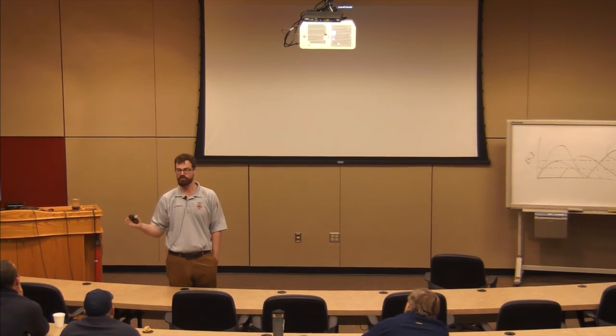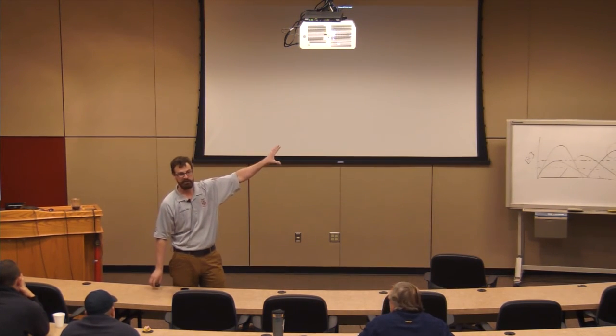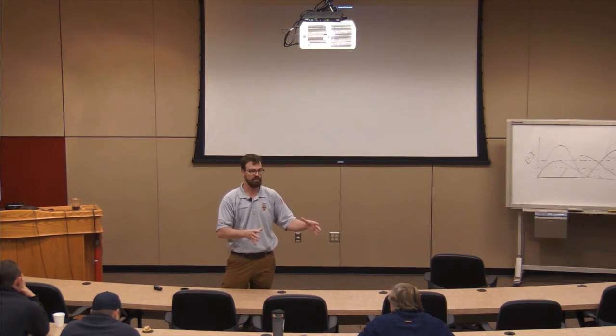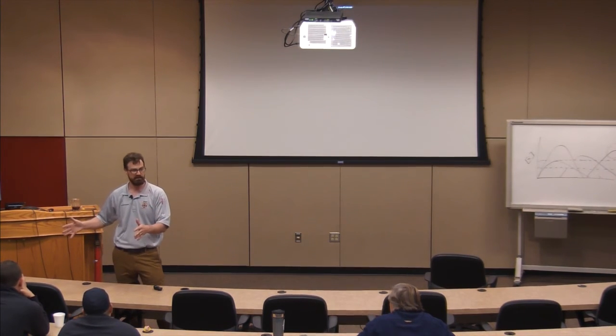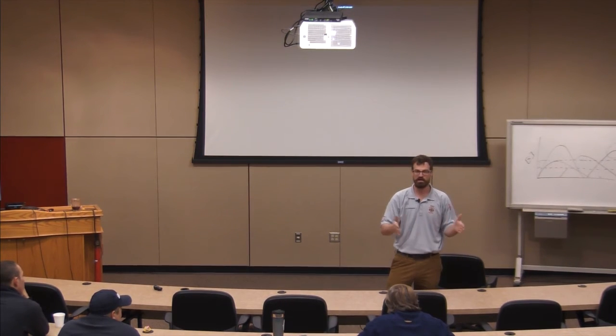So the moral of the story is you don't have to remember everything that's up here, right? We covered a crap load of material. The whole purpose of this is to introduce you to using the EKG in the setting of overdose as a diagnostic tool. We use the EKG all the time in chest pain as a diagnostic tool, and when I use it in the chest pain patient, I'm looking at ST segments for ischemia. I can take this fantastic tool and use it in the overdose setting to identify potential cardiotoxic drugs. There's a lot of cardiotoxic drugs in the community.